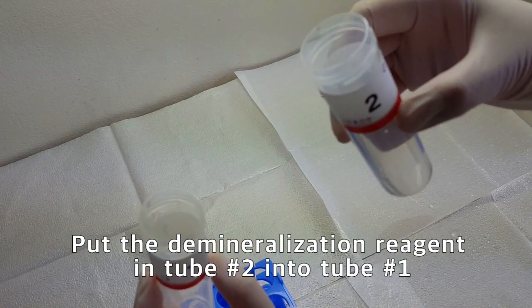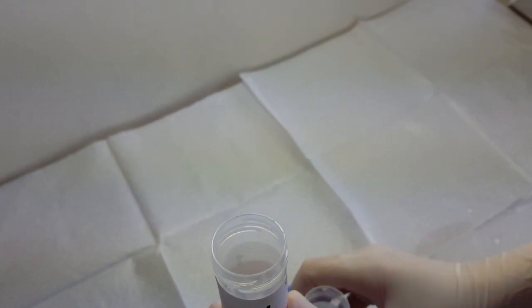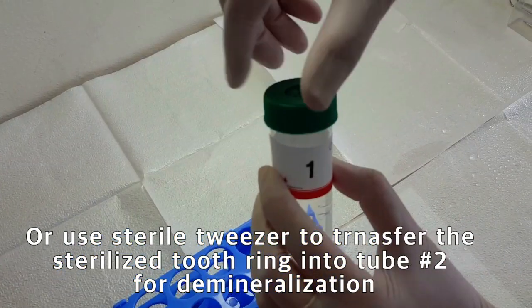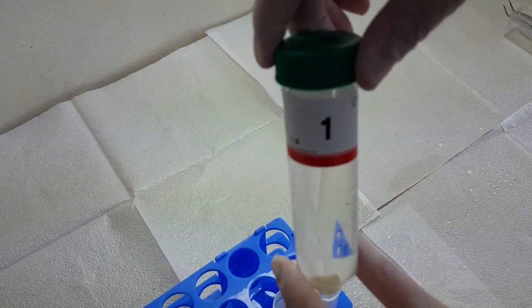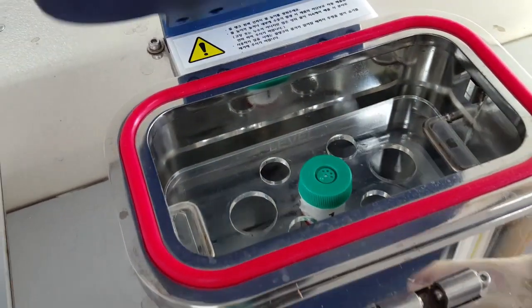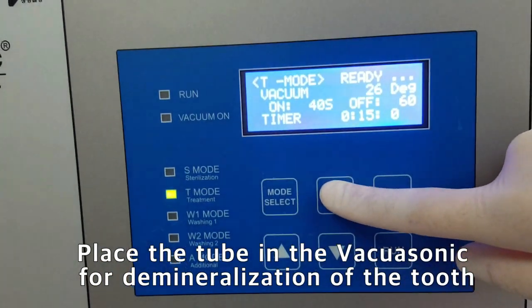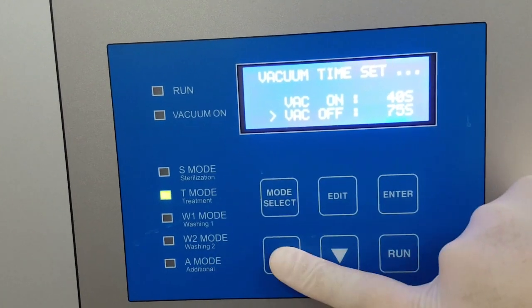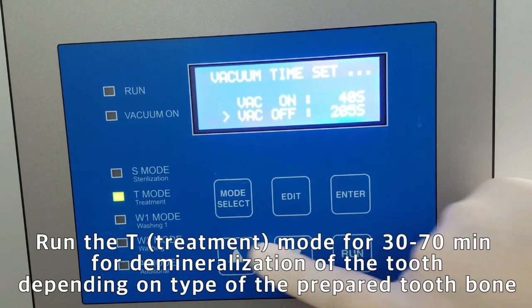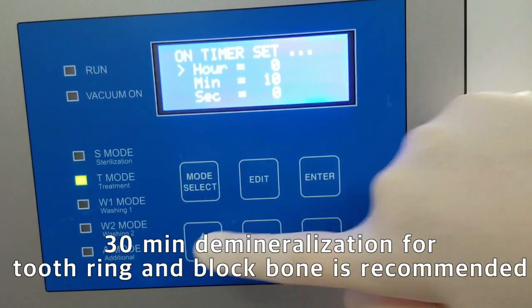Put the demineralization solution in tube number 2 into tube number 1. Or use sterile tweezers to transfer the tooth block into tube number 2 and use a new bioreactor cap. Ensure the tube and bioreactor cap remain sterile during the transfer process. Place the second tube in the vacuum sonic unit for demineralization of the tooth root. Select T-mode, which is demineralization mode, and check settings. Follow the CALESONIC setting guide for demineralization mode.